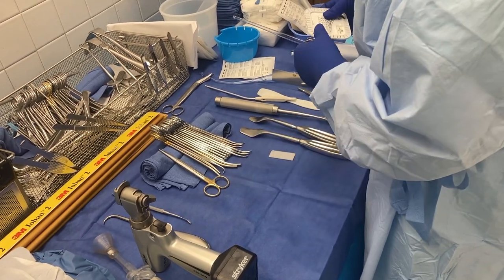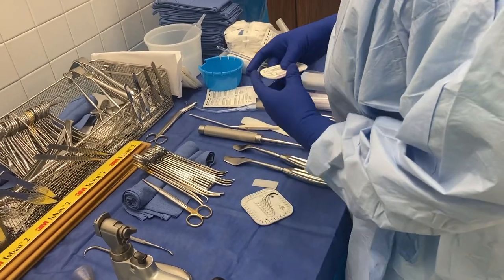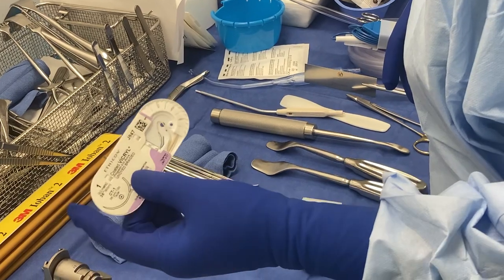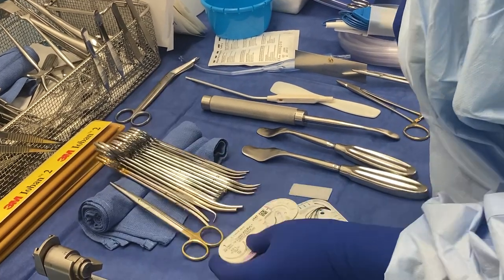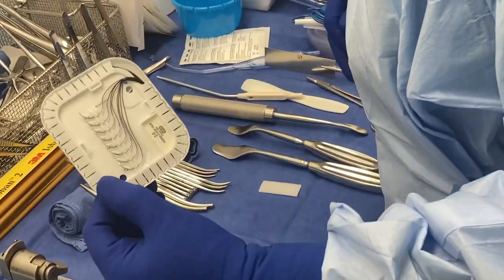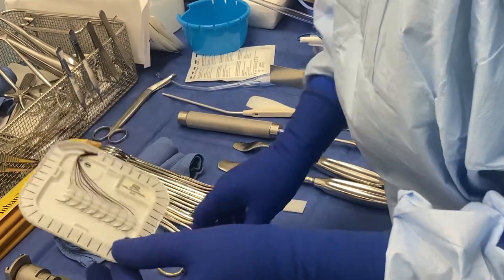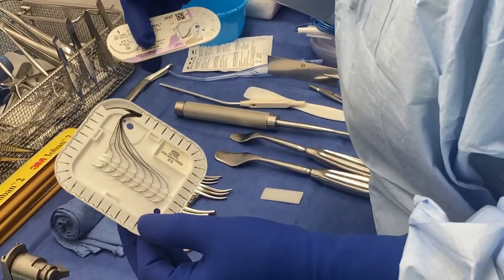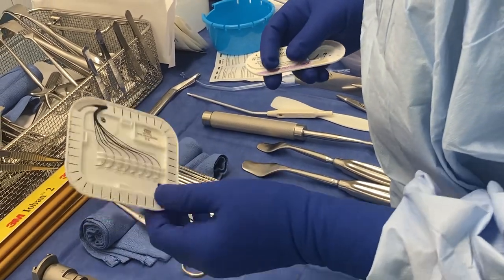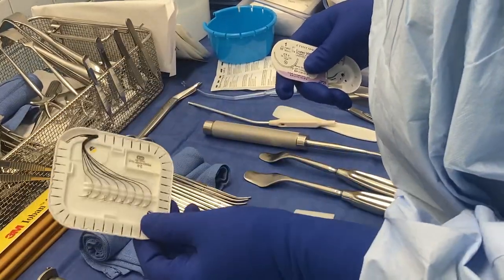That's why I have these out — to tie them with. It depends on the doctor, but you want a large suture, whatever they prefer to use. I opened a number one vicryl, which is large in diameter. I also opened two silk ties, which are smaller in size. He'll use both of these to tie the artery and the vein, and typically they will tie them twice for each one to make sure that if one suture fails, the other one will hold.